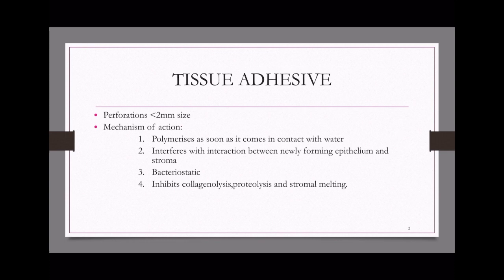It polymerizes as soon as it comes in contact with water. It interferes with the interaction between the newly forming epithelium and stroma. It is bacteriostatic. It inhibits collagenolysis, proteolysis, and stromal melting.